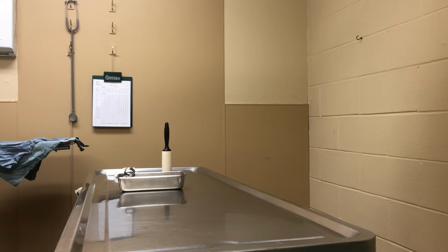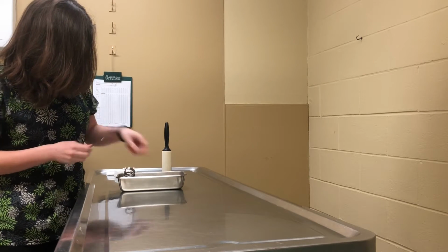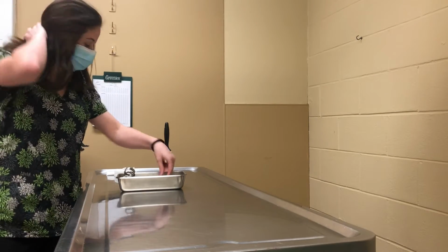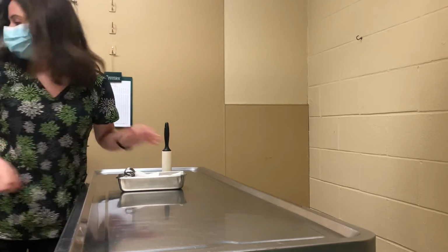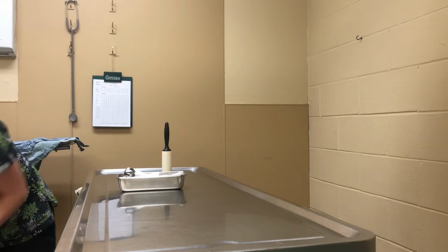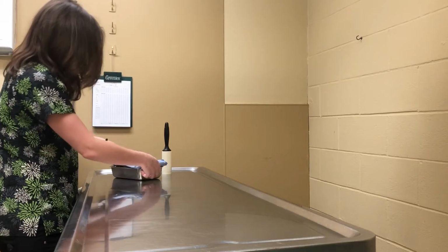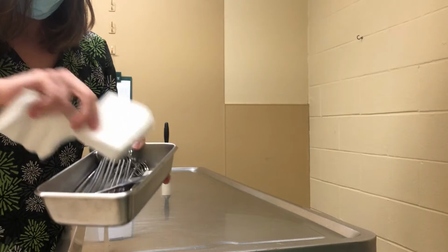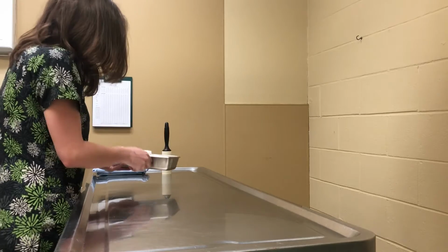Then we have our scalpel blade handle, our spay hook, our snook hook, and then I have my thumb forceps. And I'm also going to put in an indicator strip, and then I also have my new gauze that I'm going to put in as well. And then of course we put our drape right on top. So I'll just go ahead and show you what that looks like. That's what the spay pack will look like when it's opened.